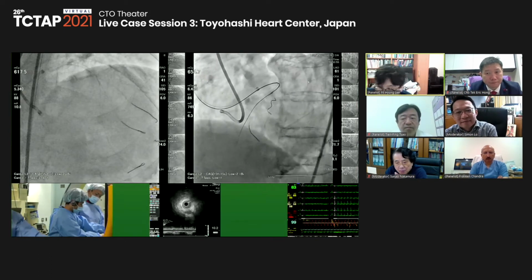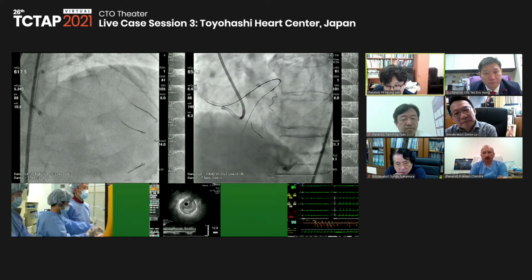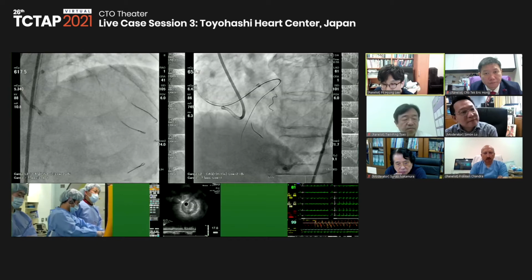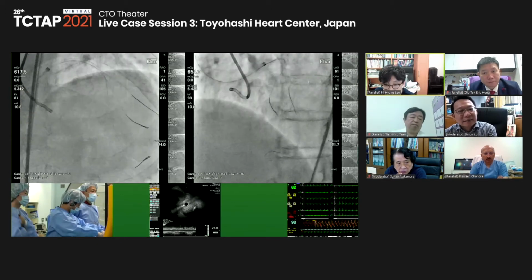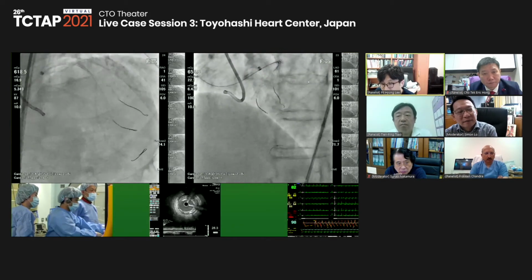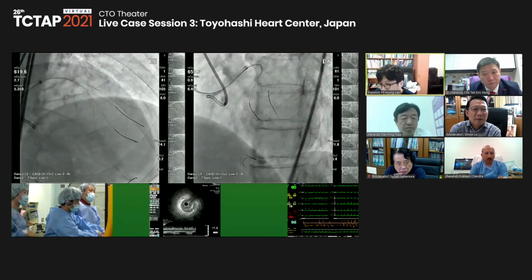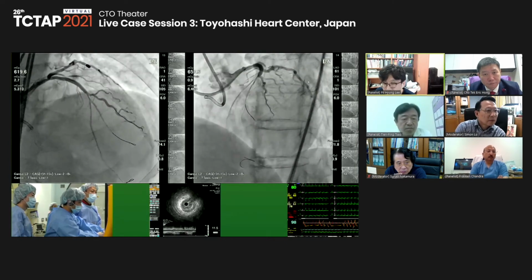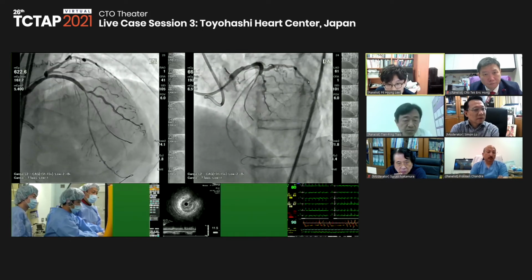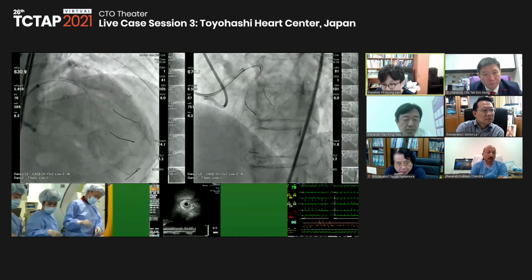Well, in this kind of situation, in my practice, I repeatedly give some nitros to see whether the vessel grows intraoperatively. But in my experience, maybe 70 or 80% does not grow significantly intraoperatively. So there's quite a size discrepancy in this kind of case, and there's no plaque.